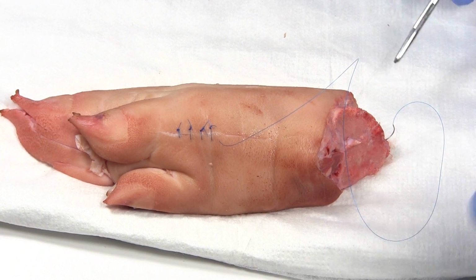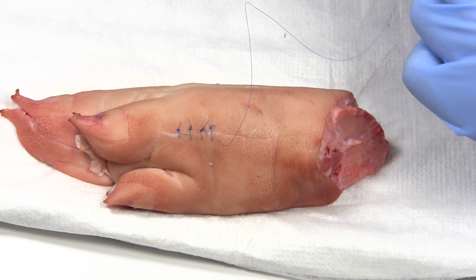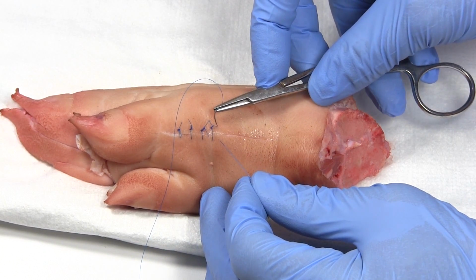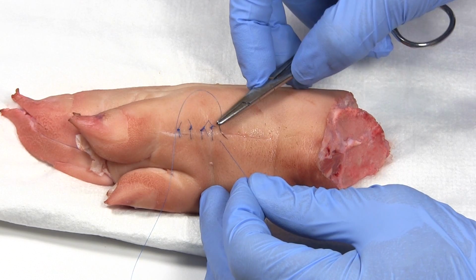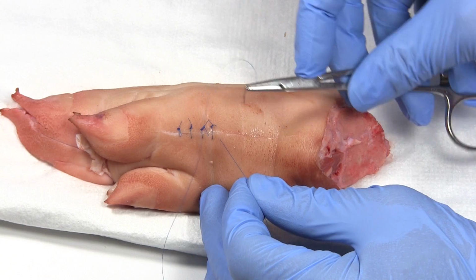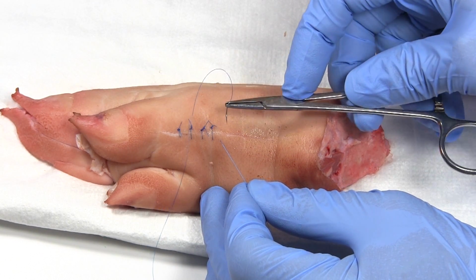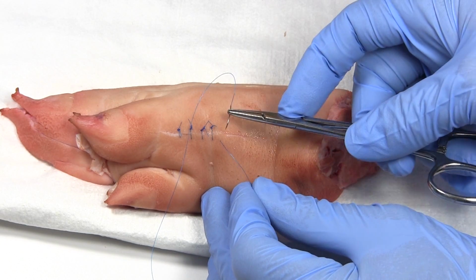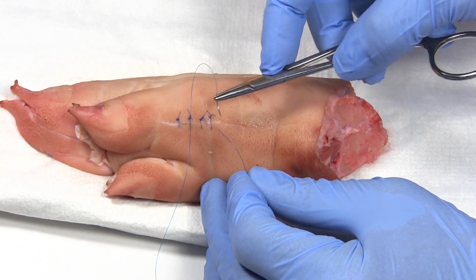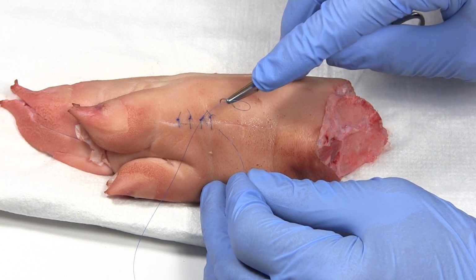From here, there's two different techniques, both of them completely correct, just a personal preference for how you go about the rest of the wound. From here, you can either go straight across for this next suture and then angle the deep part over this way, which will cause your sutures to appear on the outside straight across. Alternatively, you can go a little bit over to the side here and angle the deep part straight across, which will cause the sutures on the outside to have a little bit of an angled appearance. Again, it's completely correct. It's just a matter of whether the angled part is deep or the angled part is on the surface, just whatever you're more comfortable with. I'm going to do it where the outside is straight across.